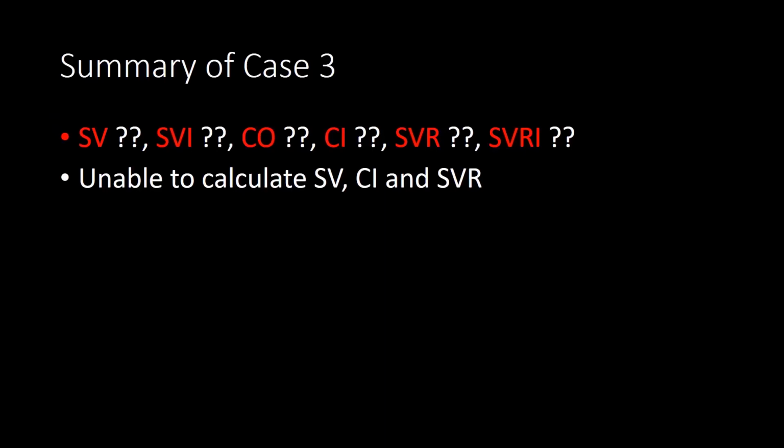And we're planning the next episode to be a little bit more of tips and pitfalls, and how you should measure it and how you can do the measurement most accurately. And don't get discouraged if you are unable to calculate it. Some patients have more difficult windows depending on their physiology or their pathologies. Maybe that day you're not able to see their views, maybe the next day you will, but just keep scanning. Yeah, and I think I would be conservative at first, and then you'll gradually get better and able to do it in more patients.